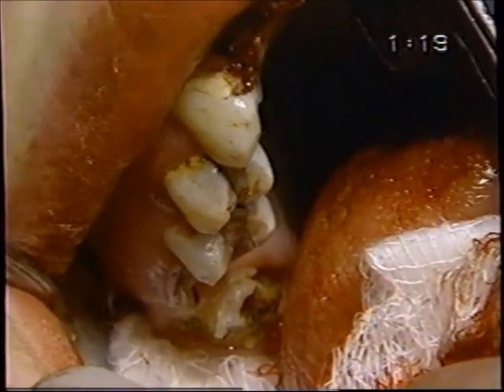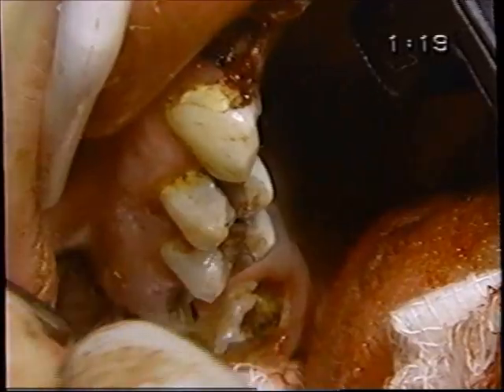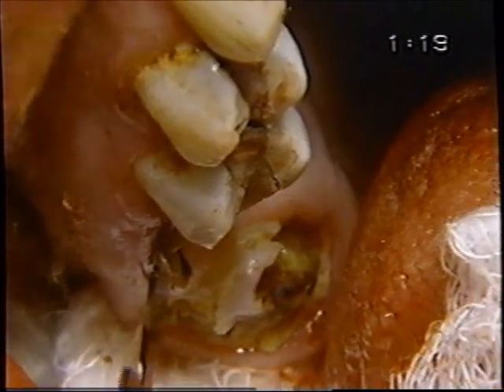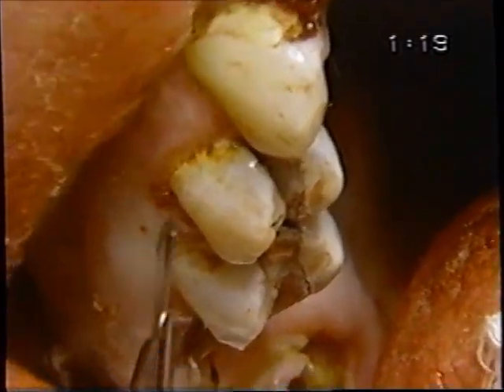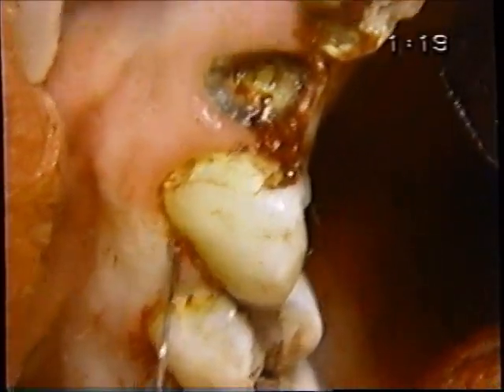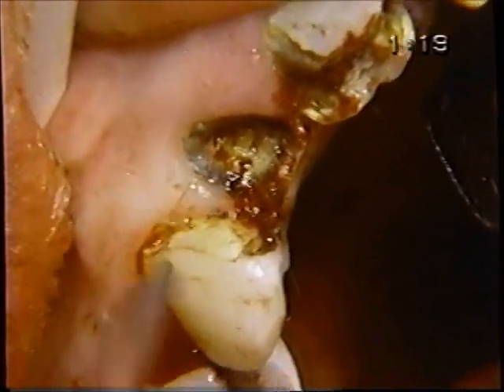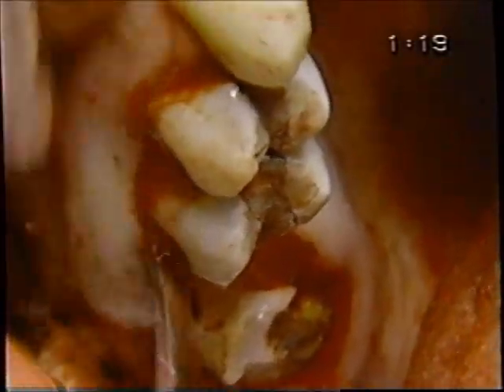Okay, now we're starting the maxillary arch on the right side to begin with. We've got a bombed out, grossly decayed second molar. The first molar is even worse. Let's remove the diseased papillae, come up maybe to the canine anyway, and then start removing teeth up to that point. So we'll come right to here. Well, we'll take out the canine too, so let's remove this papilla, incise this papilla. Okay, now with the periosteal elevator, the cervical reflection.